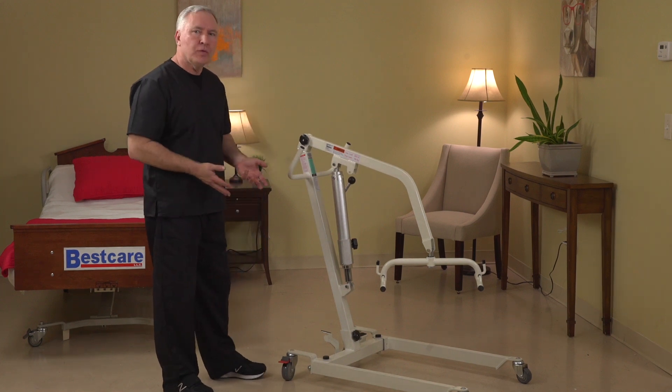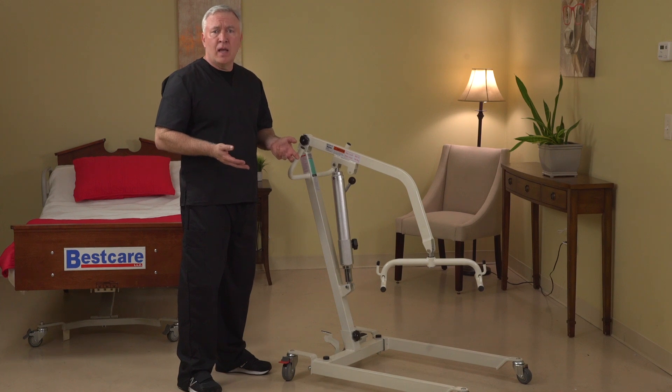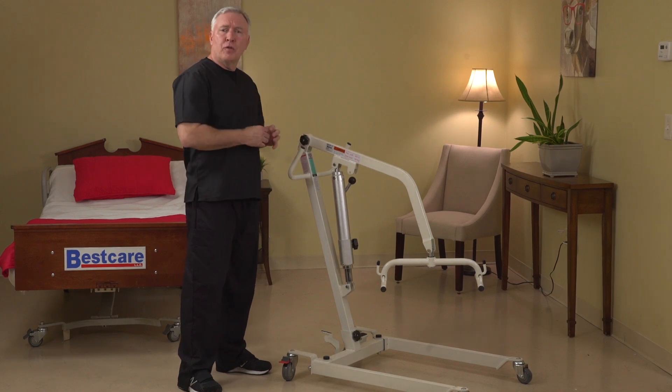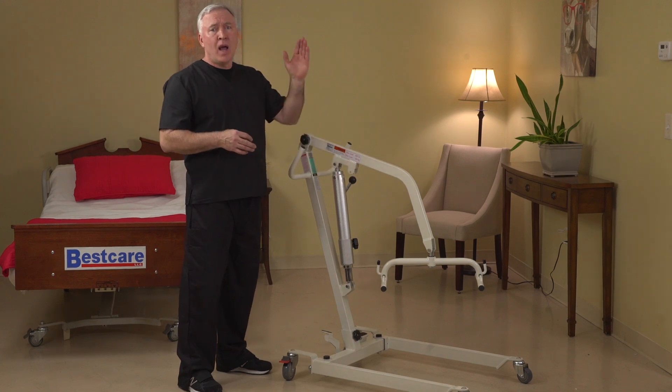This unit is a hydraulic lift that is designed to compete with hydraulic lifts that are on the market today, but at a much higher level of performance. This unit will go to the floor and get a patient quite high in the air.